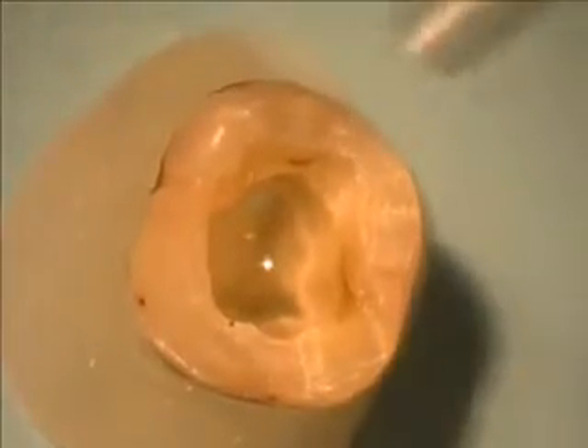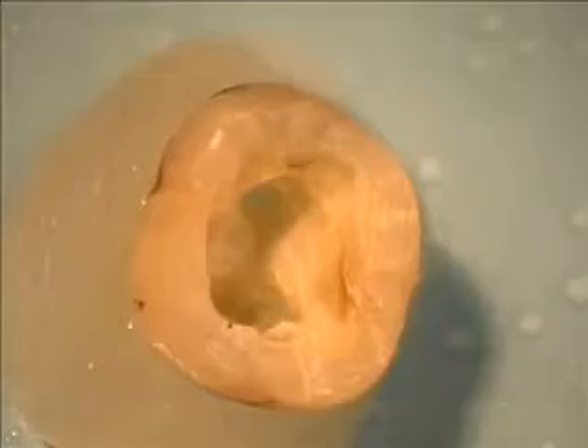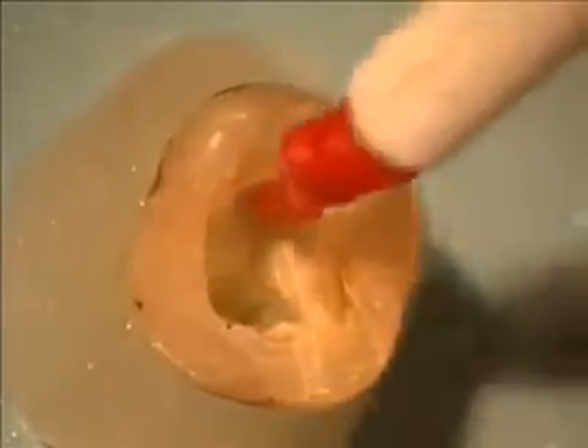Following post hole preparation, the first step is to rinse and dry the cavity very thoroughly. Simplicity One is then applied to the internal surface of the cavity in its entirety.